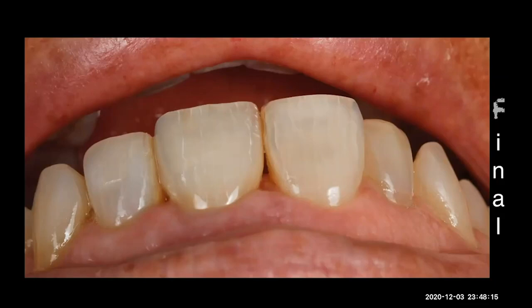Multi is an amazing block. But you know, it's a sensitive technique. When we build ceramic, I built ceramic for 15 years. That's why I have my eye trained in color and in what I need to use and what I don't need to use. So check, this is a difficult case that I did with a crown that is 95% monolithic. And I did all my movement with different colors and different ceramics, but it's about ingot selection. Ingot selection is really, really important.